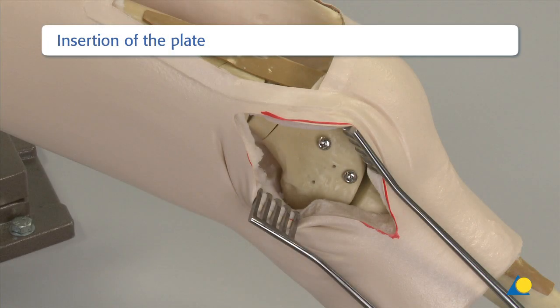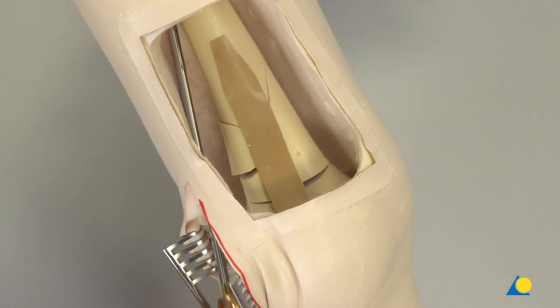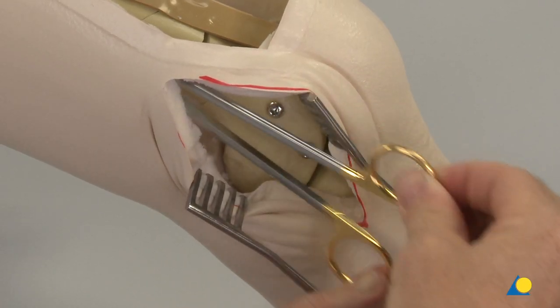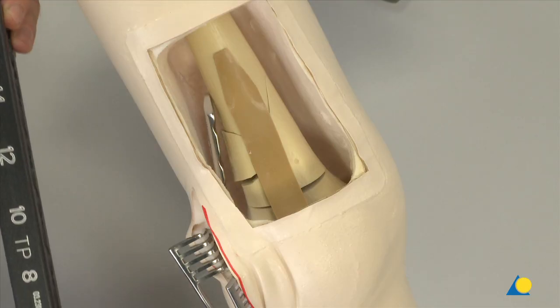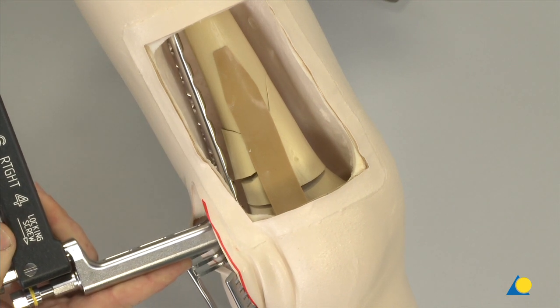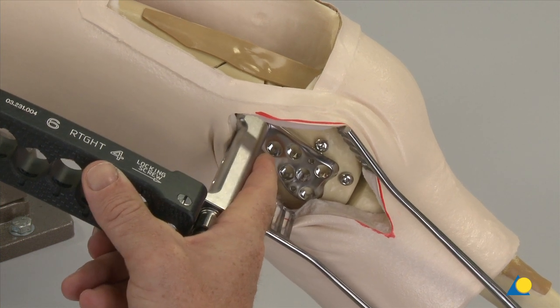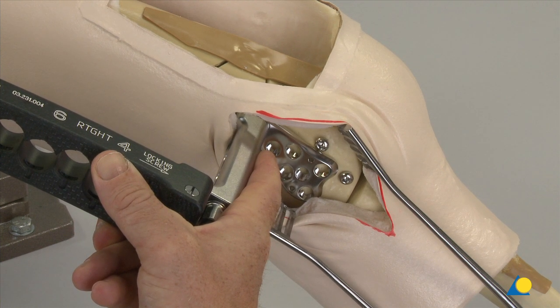Before insertion of the plate, blunt scissors are used to create a tunnel beneath the vastus lateralis. The plate can now be slid through the parapatellar approach, under the vastus lateralis muscle and along the femur. There must be no anterior gap between the plate and the bone to avoid irritation of the tractus iliotibialis. This gap is created if the surgeon tries to position the plate in an orthograde fashion and does not orient the plate to the bone surface.